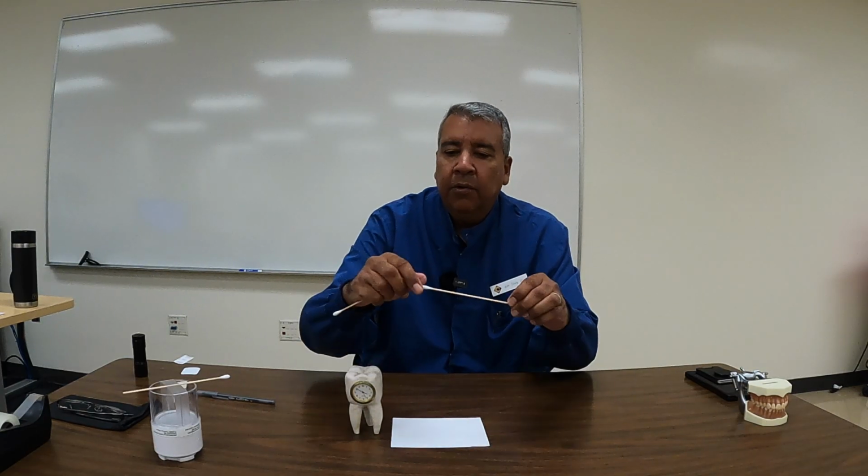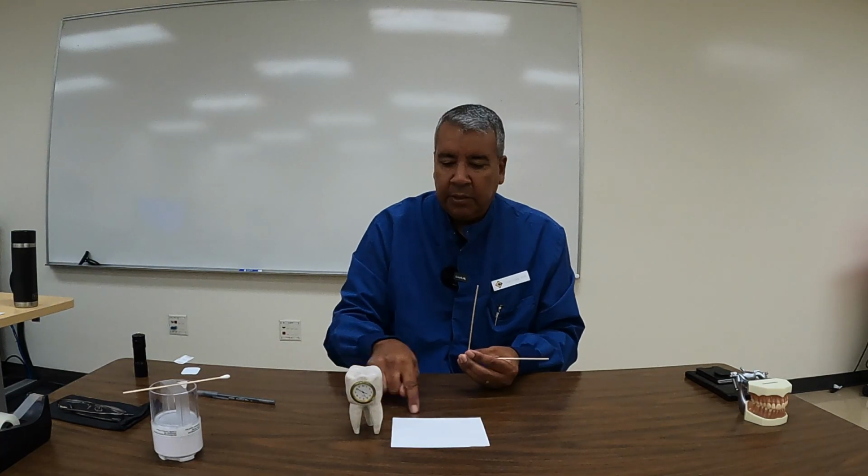It is the imaginary line going from the crown through the apex of those teeth in a general way. On this tooth, you've got 3 apices. They're all coming in at different angles, but the general direction of it is going like this. We okay so far? So this is a 90-degree angle, isn't it? This is going this way, this is going this way. So that is the angle of my tooth, the long axis of the tooth, and this is the angle of that film.